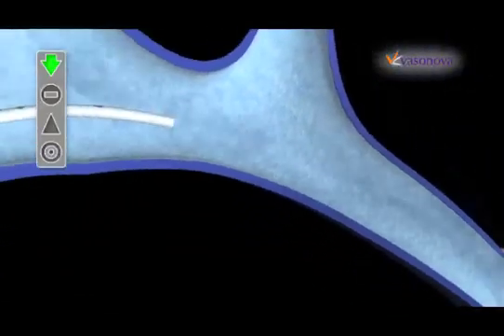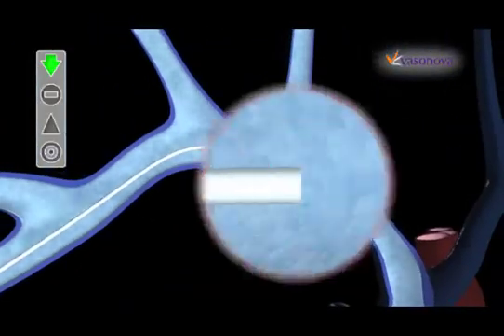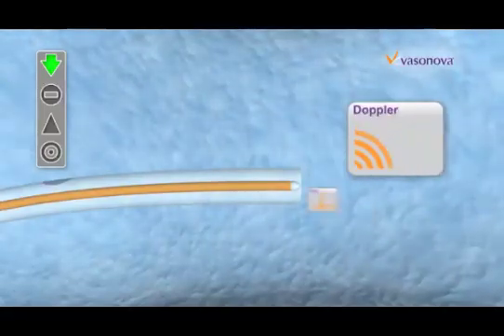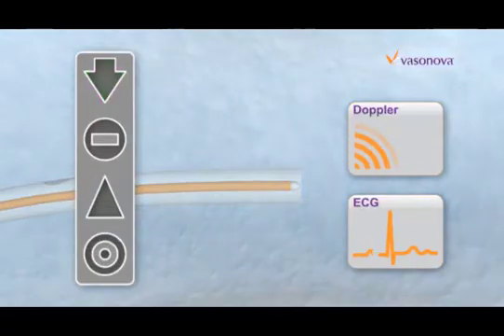Inside the Vasonova VPS stylet is a unique combination of intravascular Doppler ultrasound and ECG signal sensing that captures and measures real-time internal physiological parameters. The data is transmitted to a console where visual indicators guide the clinician as the catheter is advanced through the vasculature.